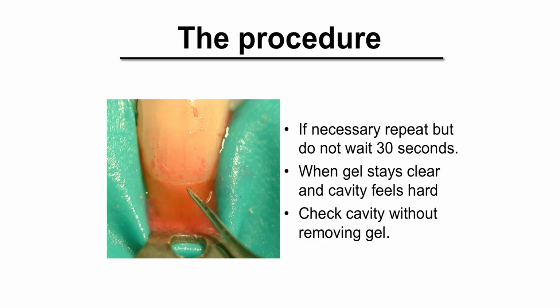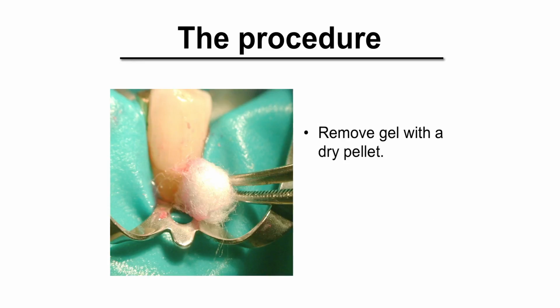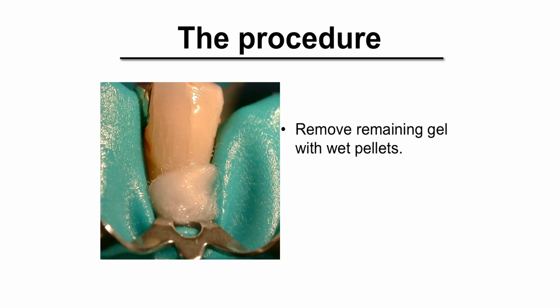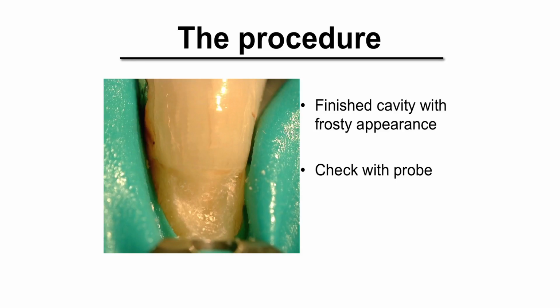If necessary, repeat, but do not wait 30 seconds. When the gel stays clear and the cavity feels hard, you can check the cavity without removing gel. Remove gel with a dry pellet. Check with an explorer. If minor caries areas are left, remove them without applying new gel. Then remove remaining gel with wet pellets. The finished cavity has a frosty appearance. At the end, check again with the probe and then fill according to normal procedures.